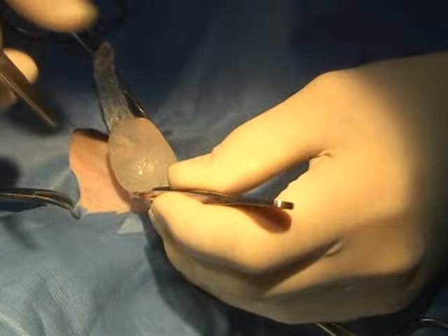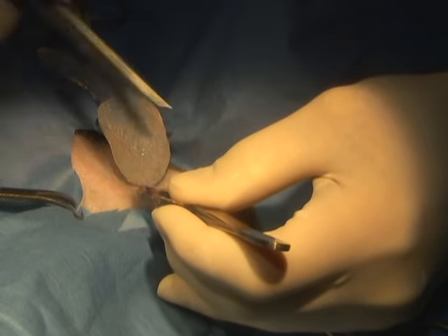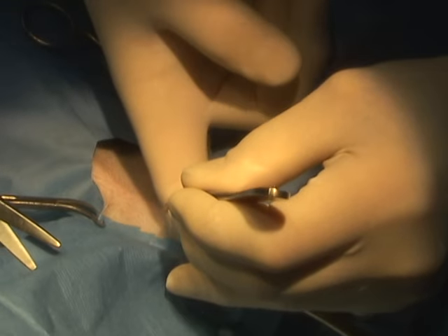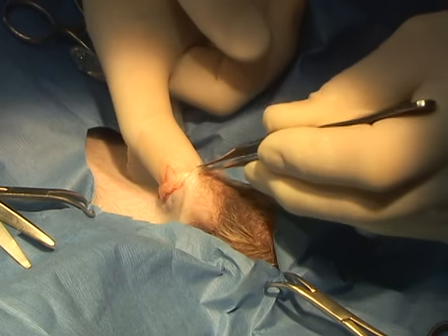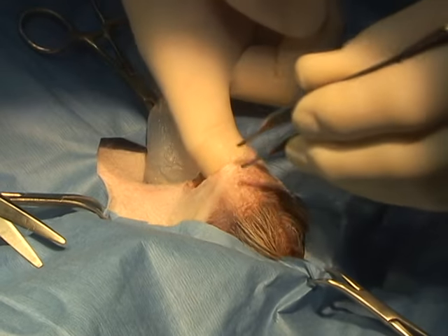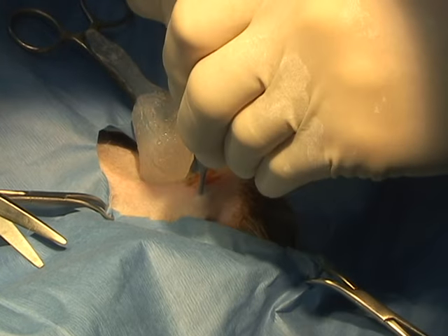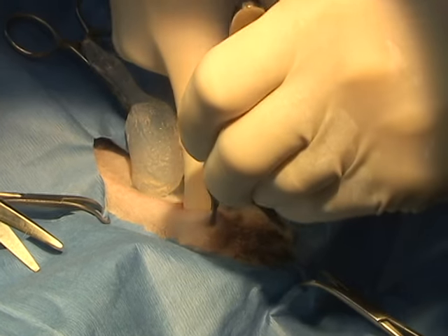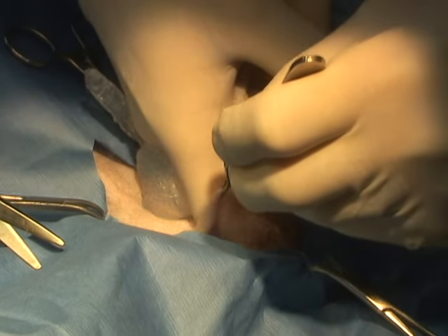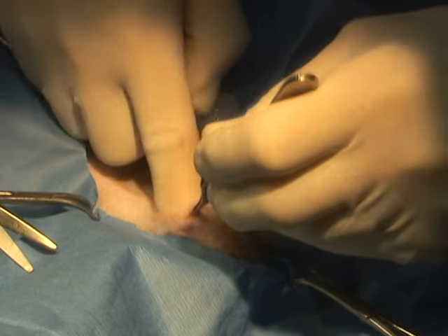We're doing an initial check just to see incision size. The testicles are pretty resilient and can take quite a lot of pressure. So what we want to do is make our opening small enough so that the testicle fits in, but not large enough that I have to worry about the testicle moving around after I close the procedure. The testicle is just a little bit larger than the end of a finger. If I make an opening large enough for my finger in a blunt dissection, I shouldn't have any trouble fitting the testicle in at all.